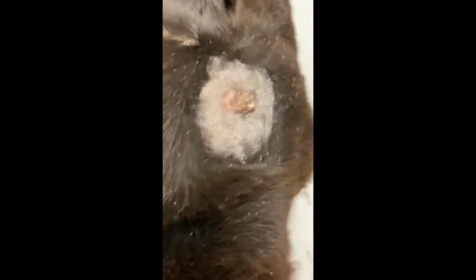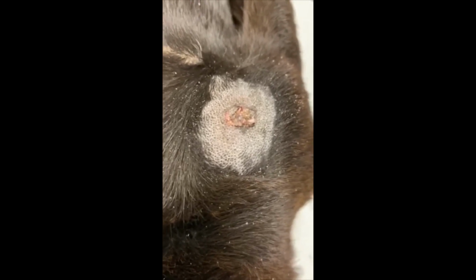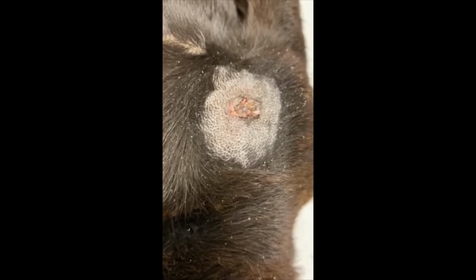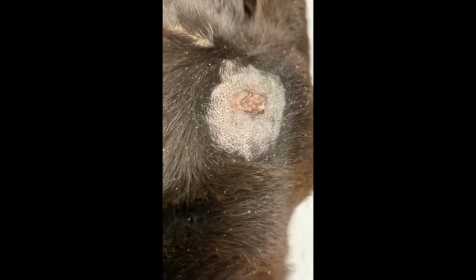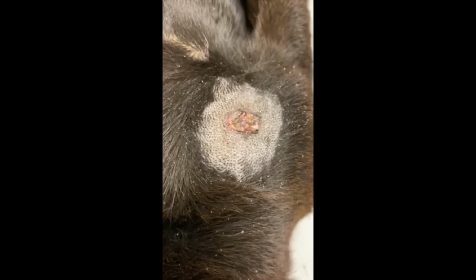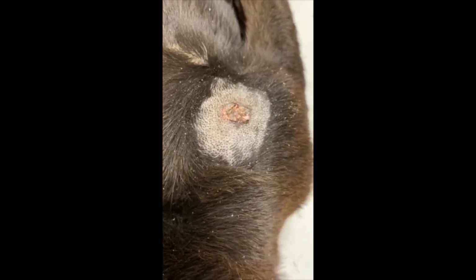This is Charlie. He's an approximate 12 to 13-year-old male neutered Patterdale Terrier. He was in for radiographic workup of his lumbar compressive lesion. And while he was here, the owner asked if we could please address this chronic bleeding papillomatous mass. Rather than surgically remove it, I offered to cryo or freeze this mass so that we could shorten the anesthetic exposure and decrease the cost incurred to the client. Lastly, Charlie is somewhat of a fractious dog, and taking sutures out after the fact in and of itself would have required some type of sedation.